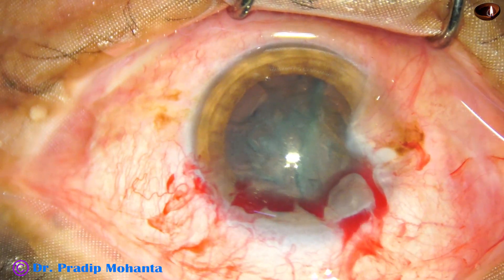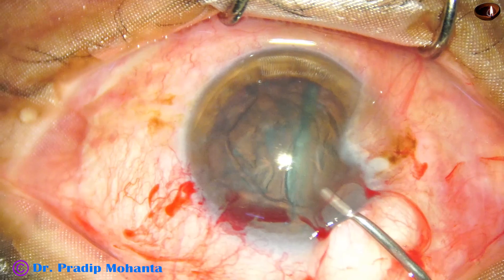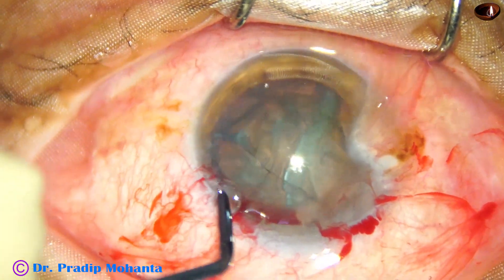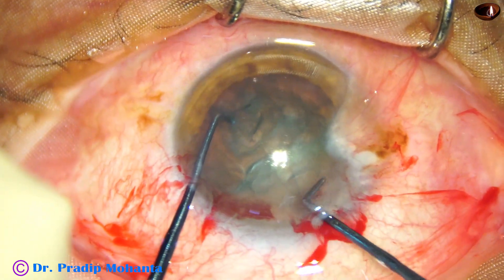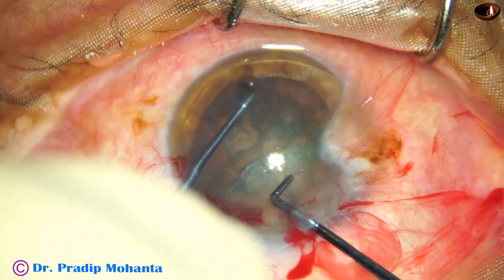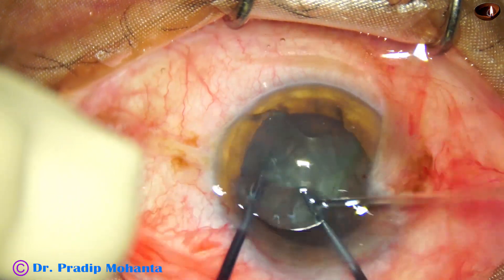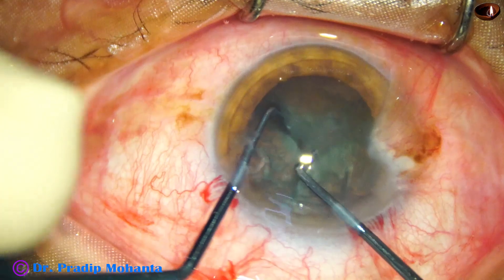The anterior chamber became shallow, so I come out, inject visco again, and now I want to make another cut — we can call this a nucleus cutter also. And here it is, another cut.